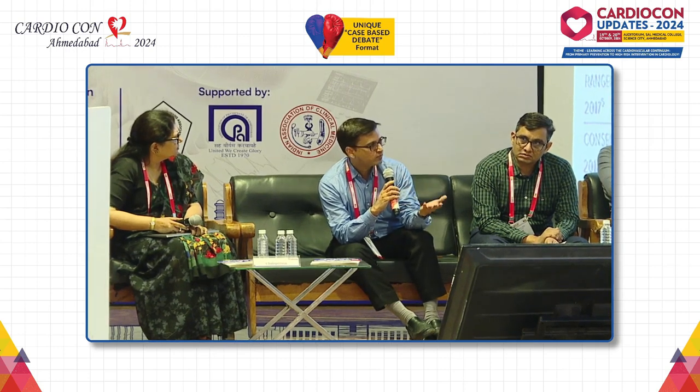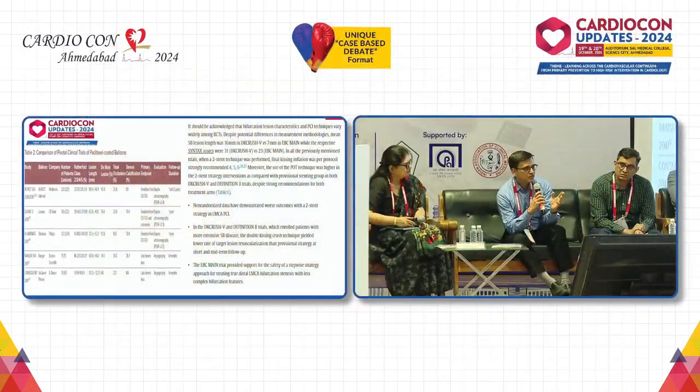Leaving behind that, if you treat with a drug-coated balloon and prepare the lesion with a scoring balloon or a cutting balloon, which would ensure that there is good luminal gain, it would definitely be a much better option than a 2-stent strategy at left main bifurcation, provided the lesion is short, focal, restricted to maybe 5 or 7 millimeters of circumflex ostium. There is some sense in avoiding a lot of metal at the circumflex ostium, especially the length of neocarina. Whatever neocarina you form, the higher the length of neocarina, the higher the chances of MACE rate, depending on the centrality of that neocarina.